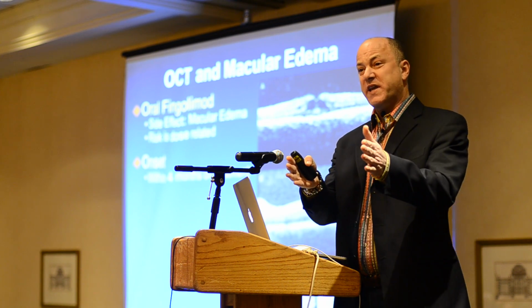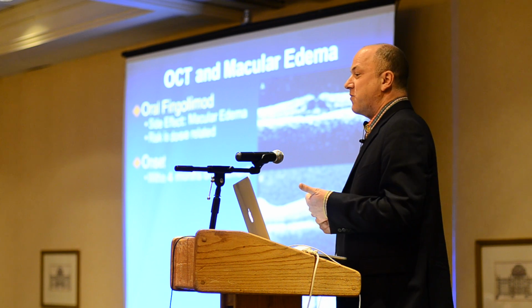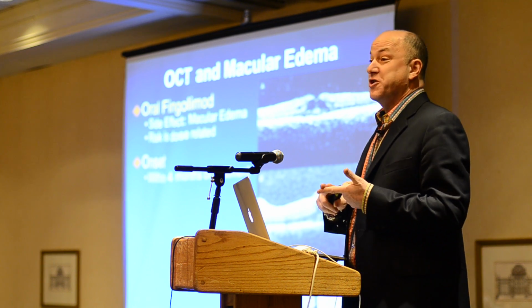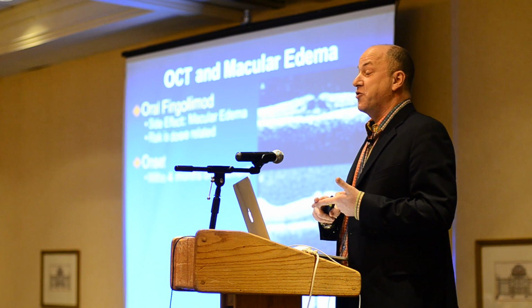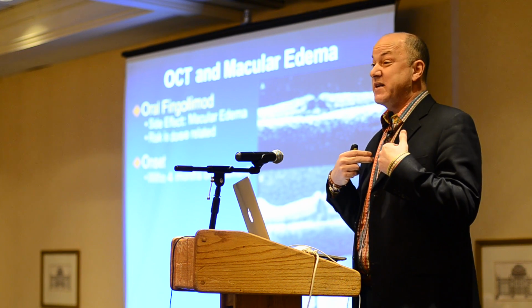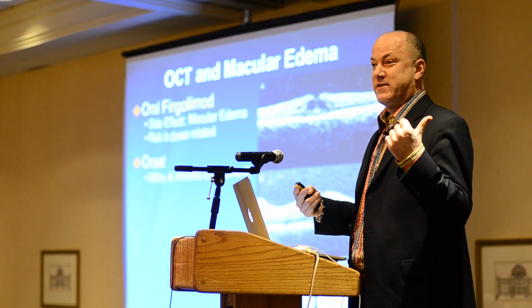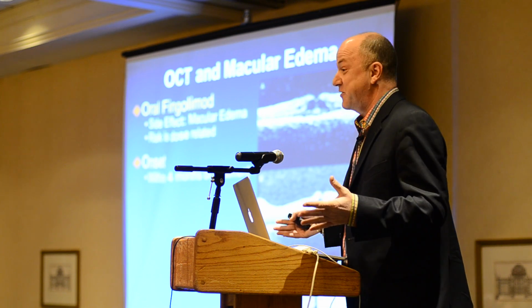So the rule in the clinic is you get a scan beforehand. Why do we want to scan beforehand? Make sure your retina is normal to begin with. Make sure you don't have any other retinal problems, such as swelling you don't know about. And believe me, since I read them all, I've seen more problems in other people's retinas that have nothing to do with this drug than I've seen any problems with the drug.